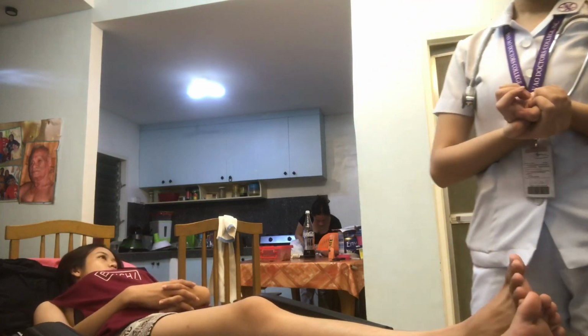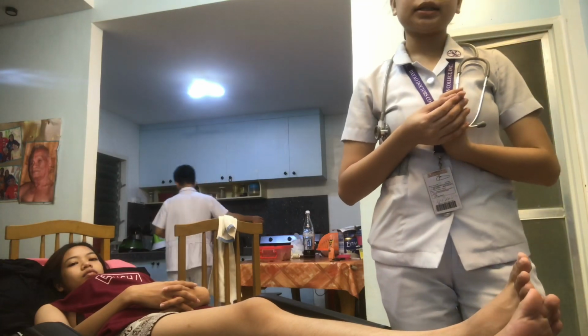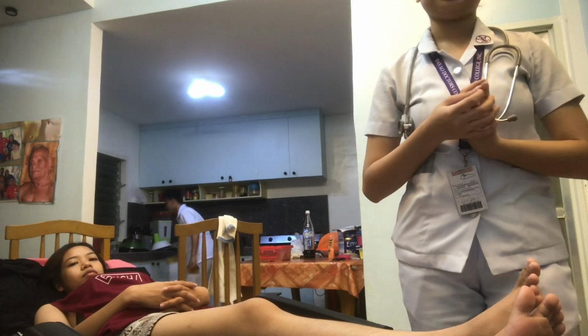Now, using the diaphragm of the stethoscope first, then the bell, auscultate the heart in all four anatomic sites, which are the aortic, pulmonic, tricuspid, and apical areas, for heart sounds, extra heart sounds, and murmurs. Ask the client to breathe regularly while auscultating. First I am going to listen to the aortic area, which is located at the right sternal border in the second intercostal space.